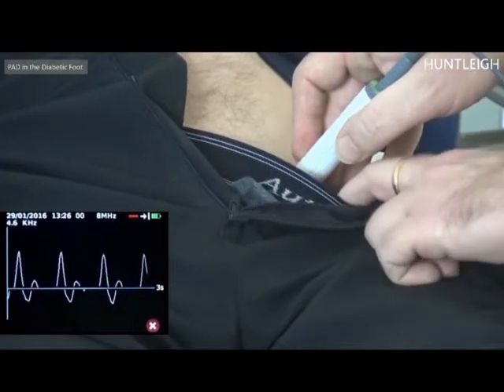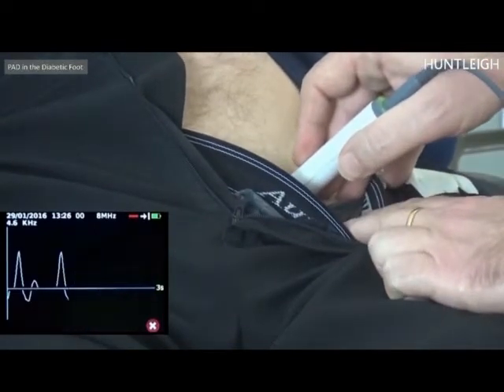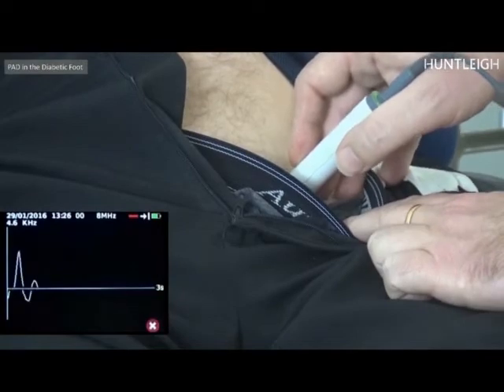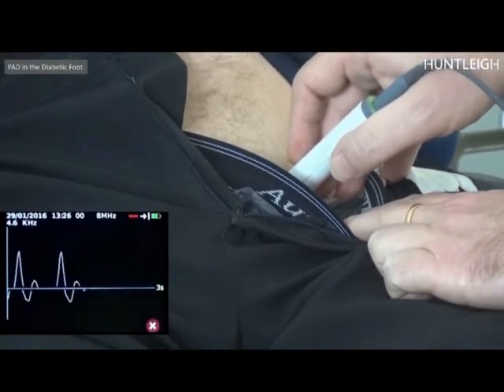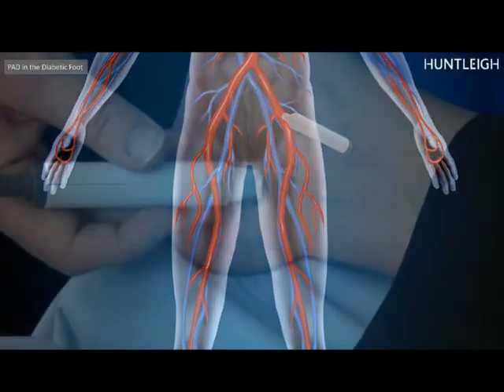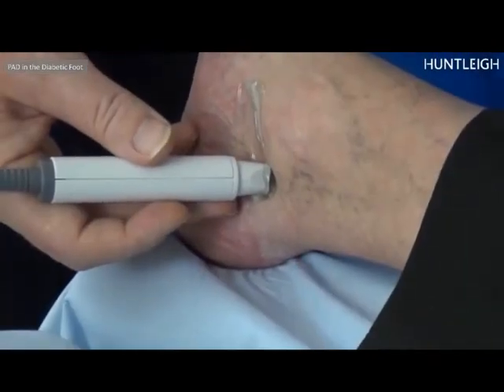To listen to the femoral pulse, place the 5 MHz probe in the femoral crease with some coupling gel, midway pointing towards the heart, and slide it slightly up and down the crease until the best Doppler signal is audibly located.